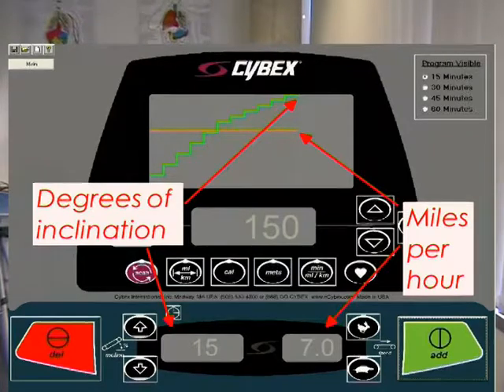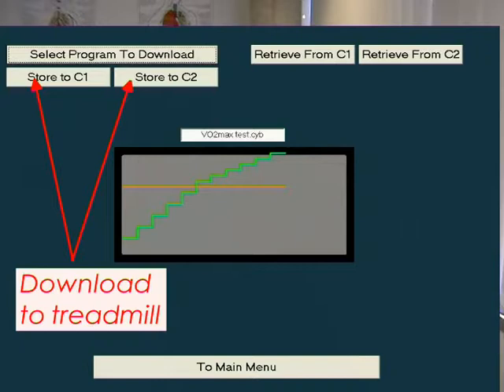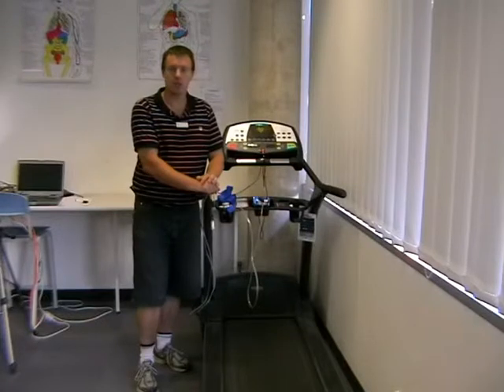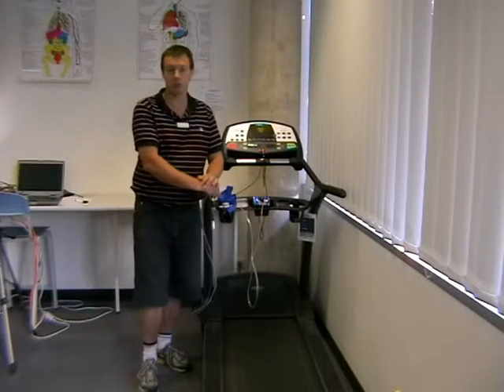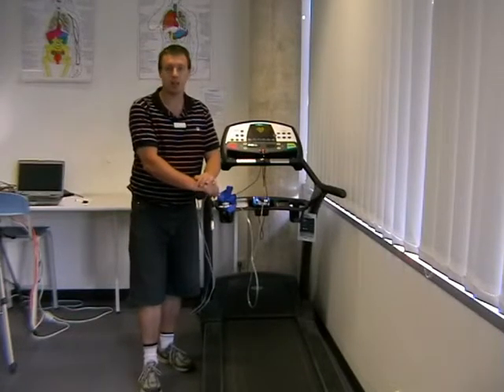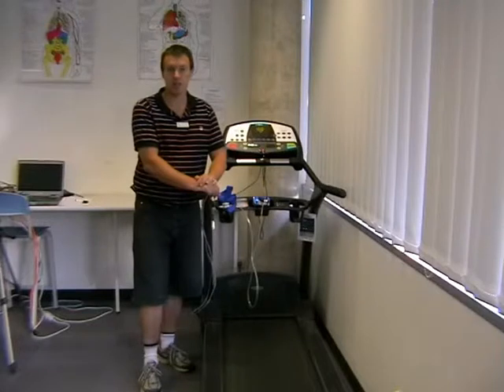Now the reason we selected this protocol was based upon one on the web which predicts VO2 max without a gas analysis system, and the formula for that is 42 plus 2 times time to exhaustion. So for instance, if a subject can last 6 minutes on the treadmill, 2 by 6 is 12 plus 42 makes 54, and that would be in mils of oxygen per kilogram of body mass. Anecdotal evidence here at the ASMS has suggested that there's a fairly good positive correlation between time to exhaustion using the predicted VO2 max and actually using our gas analysis system.